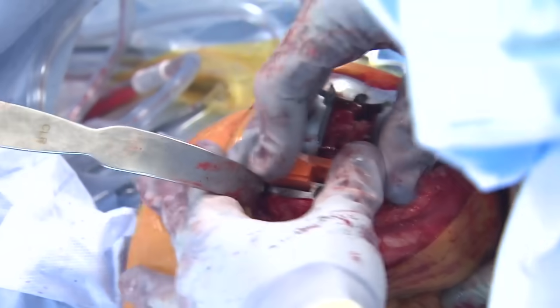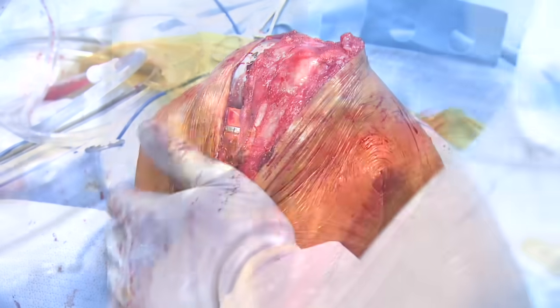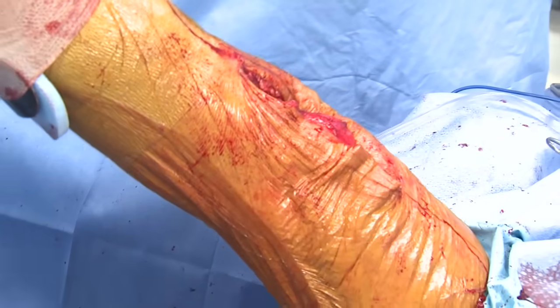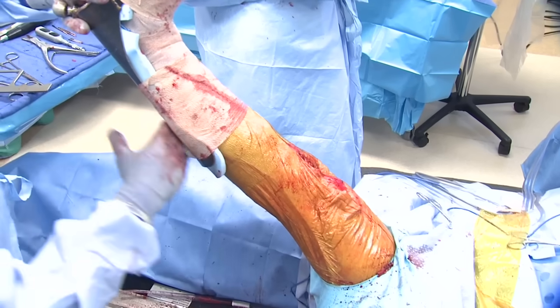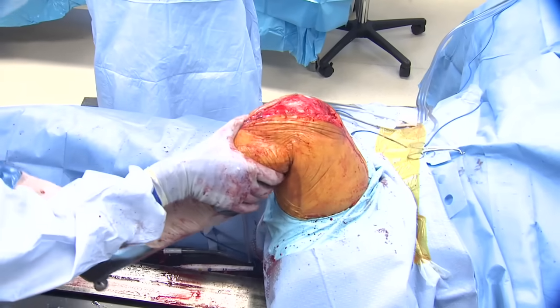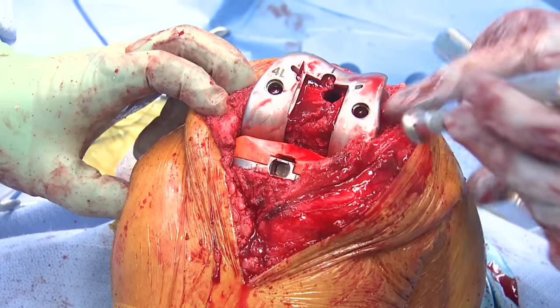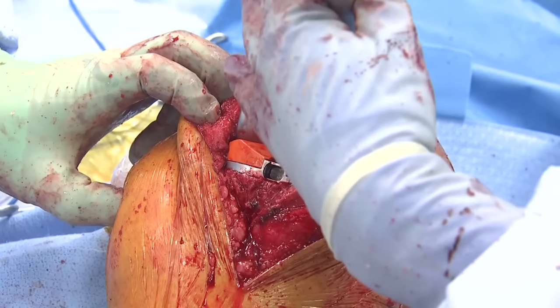The trial poly is then placed and the knee is evaluated for stability. Patellar tracking as well as status of the PCL is evaluated, in addition to valgus and varus responses to stress. Terminal extension is identified and maximal flexion is demonstrated. A solid endpoint for the PCL is identified additionally. Appropriate medial lateral positioning of the femoral component is identified and lug punches are done.